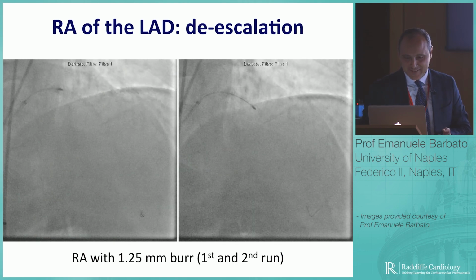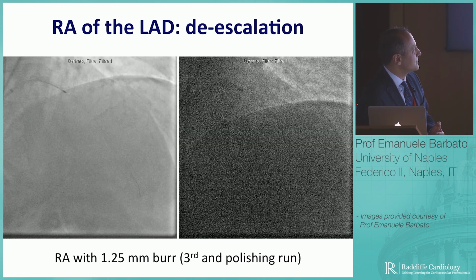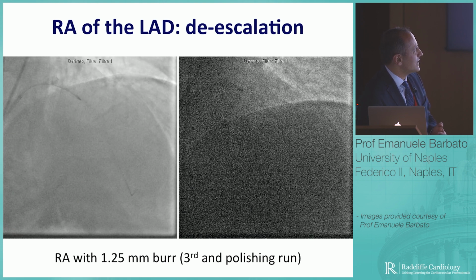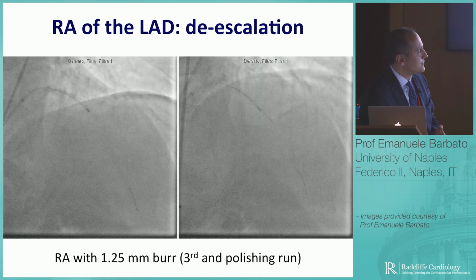You gotta be patient, huh? That is the bottom line of this case, be patient. Third run. There you go. And this is a polishing run. Okay.